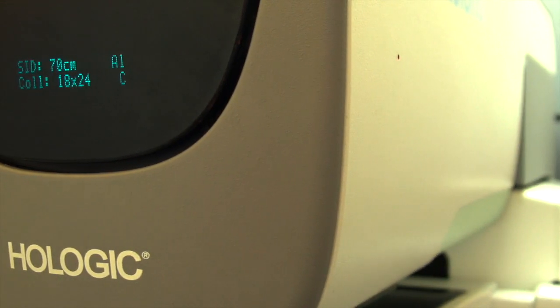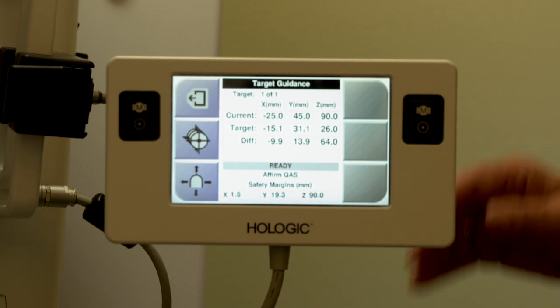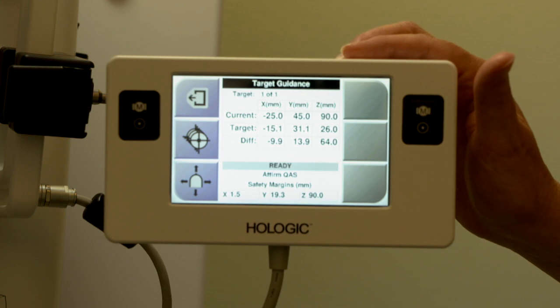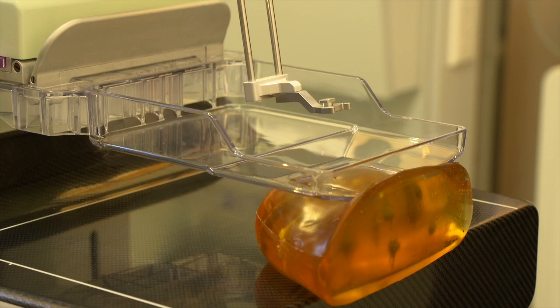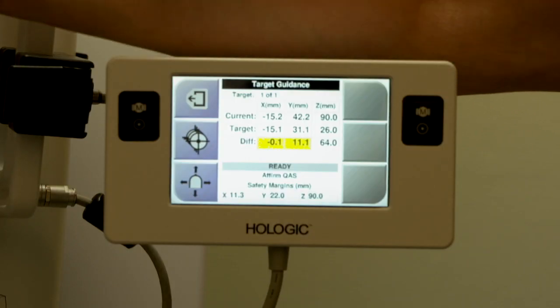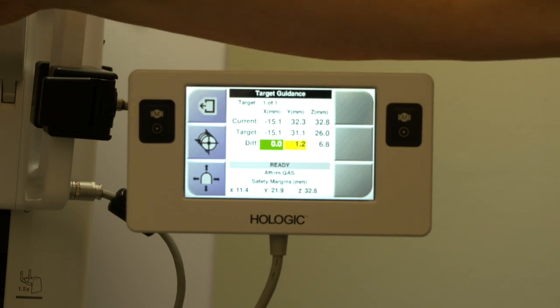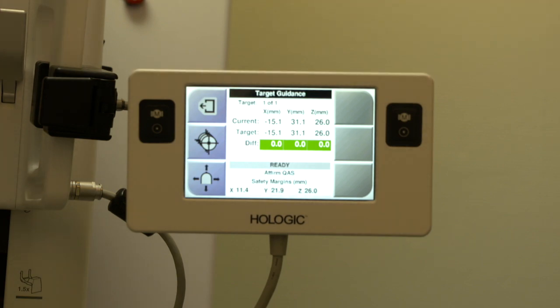The source to image distance is 70 centimeters which makes it much easier for biopsies. Here we have our biopsy control module. So when we're at target we just move it like this, then we bring the Z value down, and when we have three green lights we are at target. With regards to QA, we follow the NHS BSP guidelines and we can customise the QA per department.